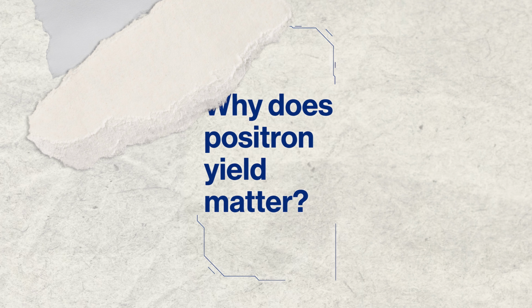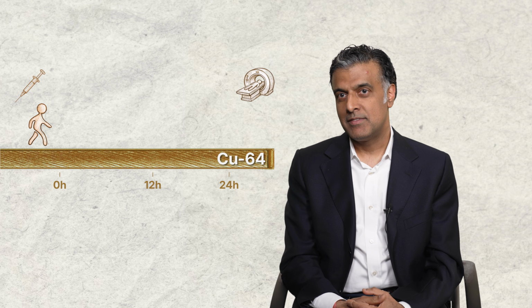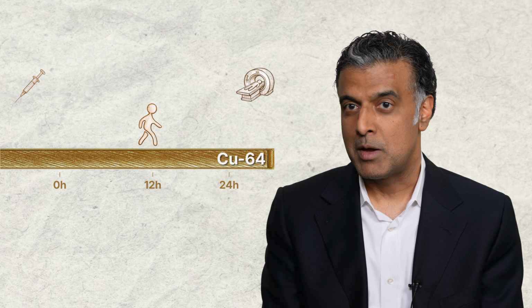If you think about the main agents that are approved by the FDA for oncologic imaging, all the uptake that we experience is about 1 hour. You get the patient, you inject the dose, and about an hour later, you're imaging the patient. But with the lower yield, there are papers that show that copper-64 PSMA has greater sensitivity and specificity only at the 24-hour mark. And now you have a patient who comes in, occupies a room where you're going to inject them. They're not only just coming in and not getting a scan, but then you send them away. Then you hope they come back at the correct time.